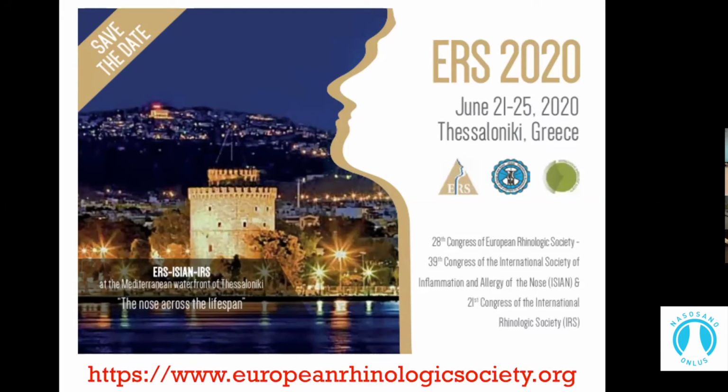What is your recommendation for the correct use of the MRI in recognition of CSF leaks, fungus balls and cancer? This question is coming from the United States. Yes, MRI scans in cases of meningoceles or meningoencephaloceles. We don't use it in iatrogenic cases, because then with CT scans, if we have the defect at the skull base, it's obvious. But MRI only in meningoceles, meningoencephaloceles, etc.